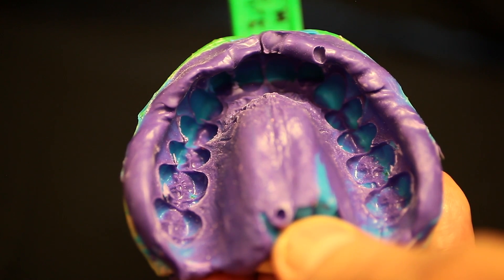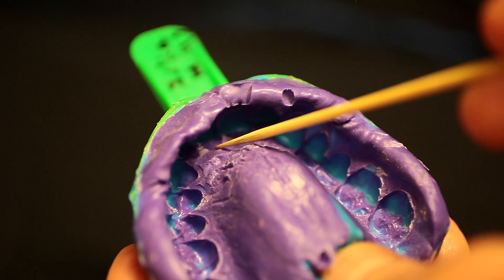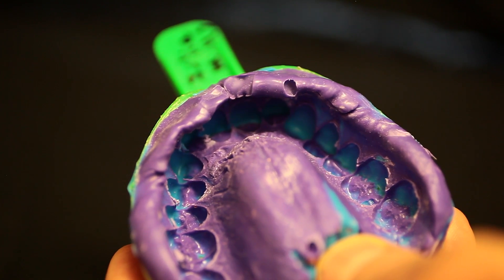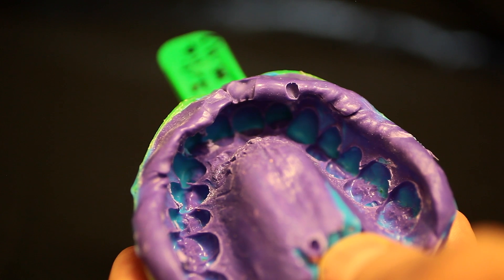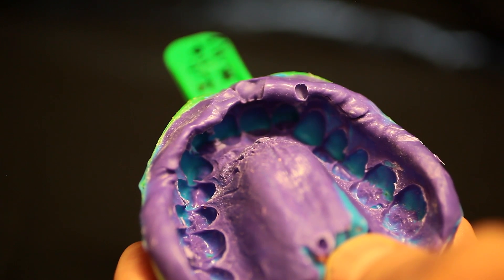Now you might be thinking you'll just use polyvinyl — that you can pour it a hundred times. Let me show you why that isn't true. Here we have a polyvinyl impression that's been poured one or two times, and already we're starting to see some tears and pulls here, up in here, over in here, along the inside edges. So the models coming from this impression will no longer be identical, making it difficult for your transfer jigs and matrices to fit accurately and transfer properly from model to model.